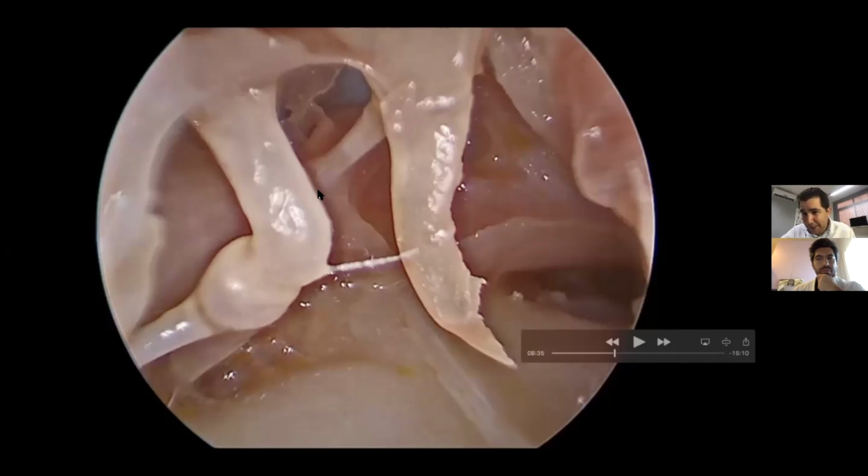When you have that, you have a blockage at the tympanic isthmus. If the posterior isthmus works, probably you're going to be fine, maybe with some retraction. But if the tympanic isthmus is also blocked, you will have two compartments: one compartment below, which will depend on the eustachian tube, and one compartment above, which will depend on the mastoid, because there's no communication if it's completely blocked.